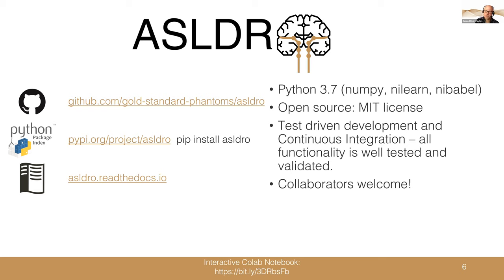So the only question will be, are the models correct in the first place? And obviously that's slightly outside the scope of some DRO software. It's more for the research, but new models can be implemented. You can make comparisons. All these kinds of things can be done inside the software.